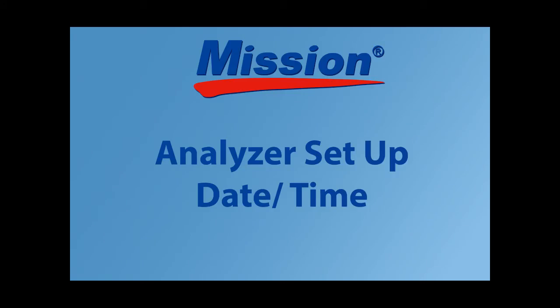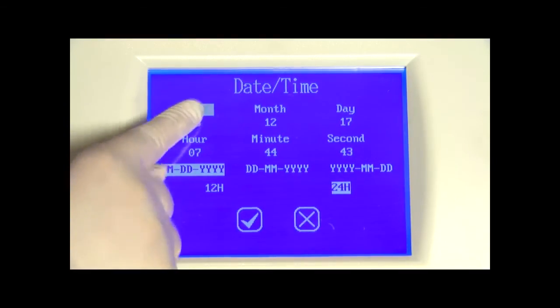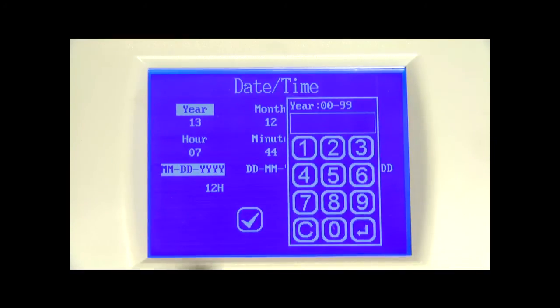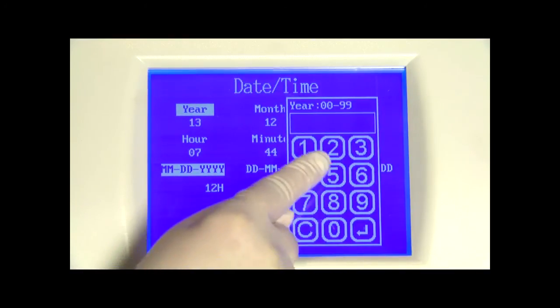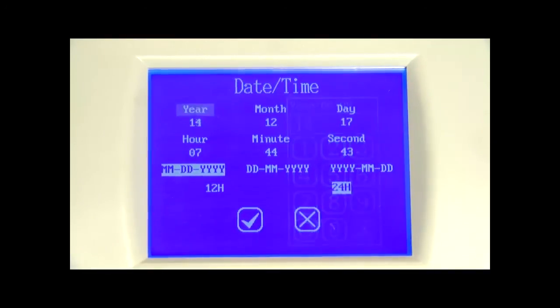From the main menu, press the date/time icon to change date or time settings. To change any of the date or time settings, press the appropriate display area — either the name or associated number. This will bring up the numeric keypad for entering the proper year, month, etc., with the corresponding range of numeric input. Proceed to enter the correct numbers for all date and time entries.